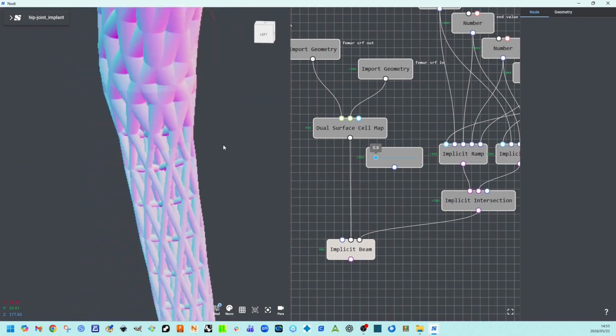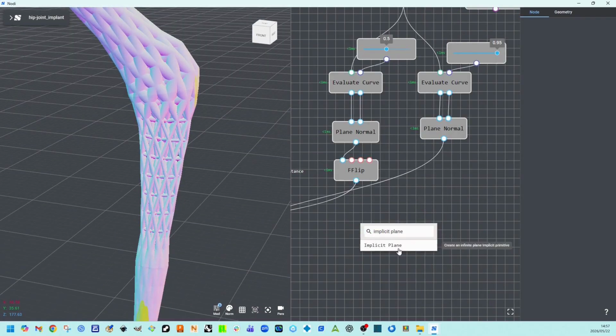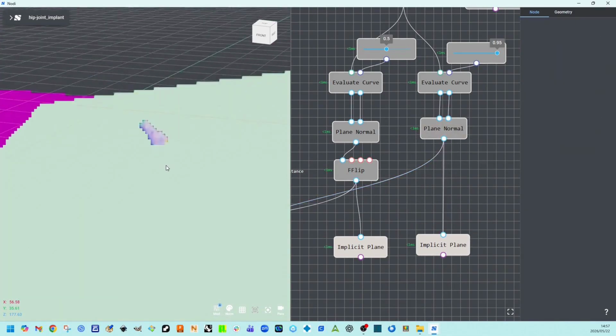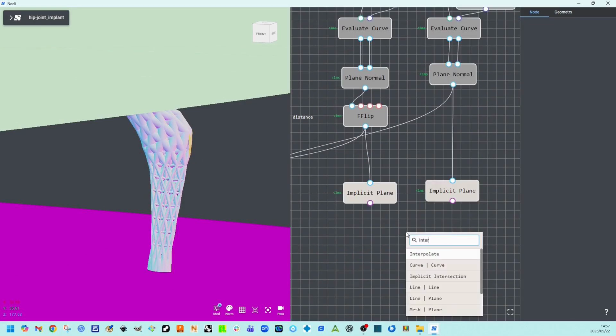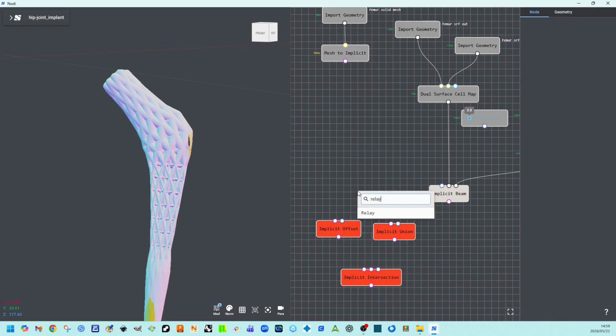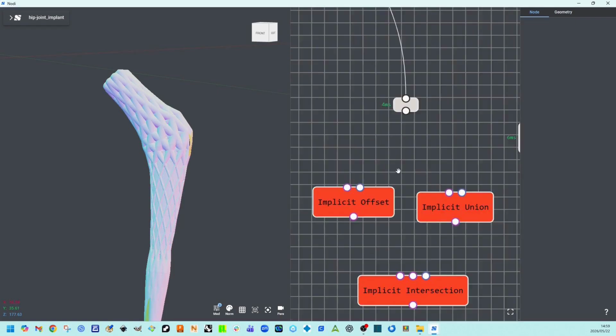To clip the lattice region, we add 2 implicit plane nodes built from the perpendicular planes. To create the solid shell, we run the femur mesh through mesh to implicit, then implicit offset, thickening the surface inward.